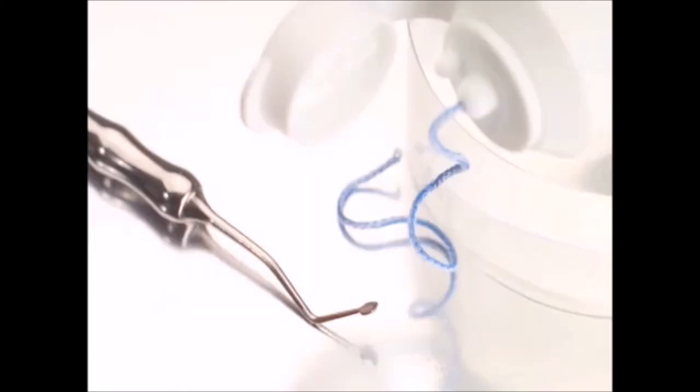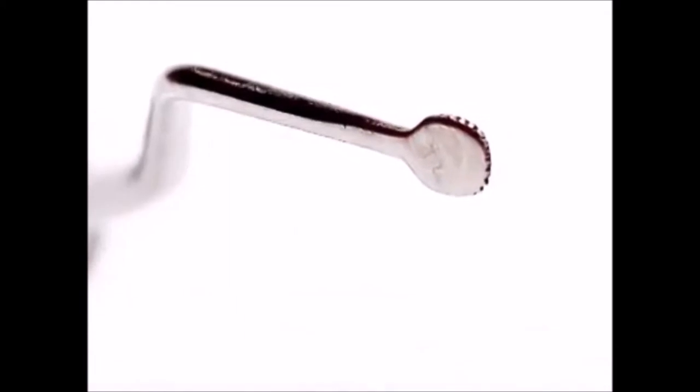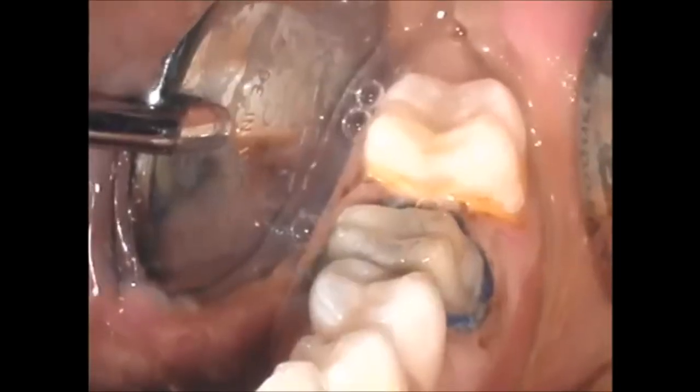In general, knitted cords are most easily placed with a thin packing instrument. Ultradent offers serrated packers and the large and small slide packers. An Ultrapack knitted cord is soaked in Viscostat and then packed into place.